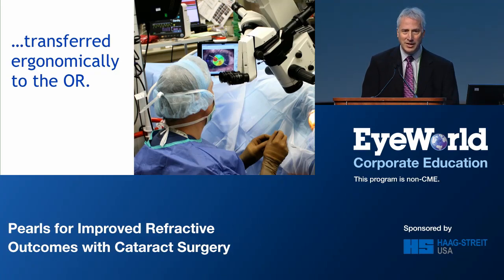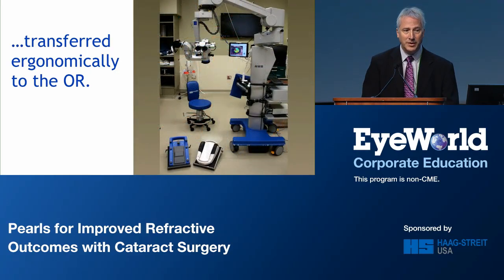Now, some of you may not be as lucky as I am to have the wonderful Haag-Streit microscope available. Haag-Streit has actually made the platform available so that the Lenstar software can be run on Citrix. And this image is actually showing the Lenstar software run on Citrix, showing up on an iPad on a flexible device, which I can glance up at, even with a different kind of microscope and OR system. You can see just to the left of the base of the scope, there's an articulating arm holding up that iPad, and I can put it wherever I want to look at it very ergonomically.